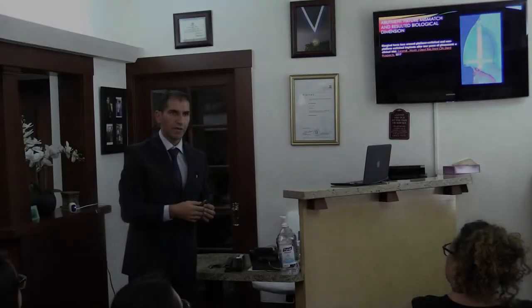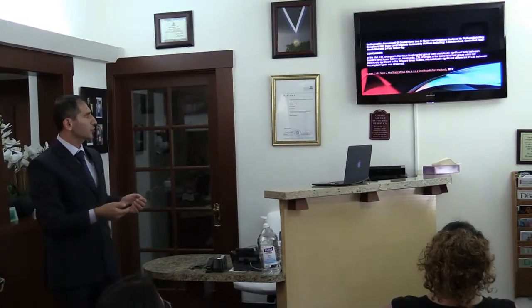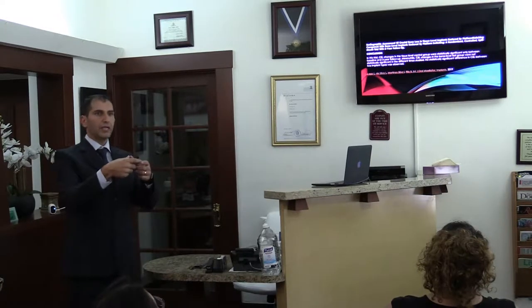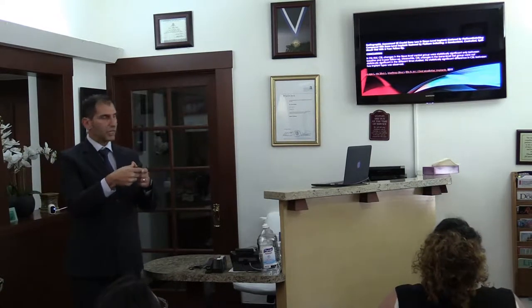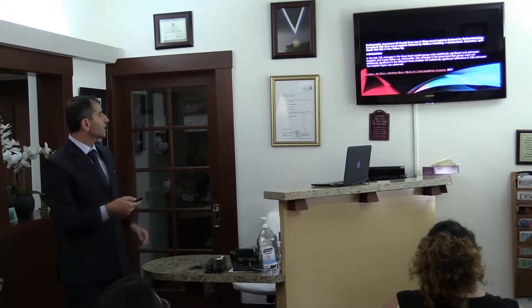True mismatch. So you want a mismatch. And there's also extreme mismatch too, where you get a very narrow neck. And I'll show you in the pictures coming out. Another study here is Lagola.